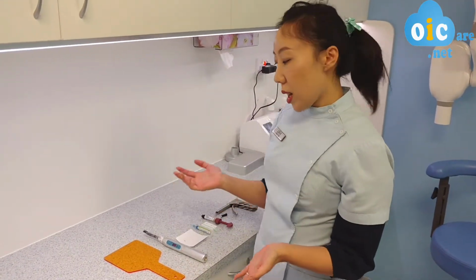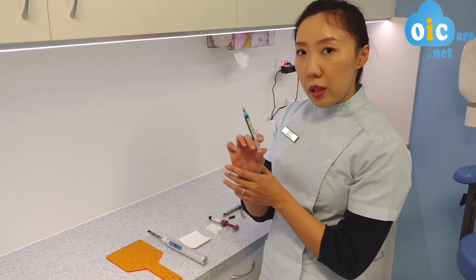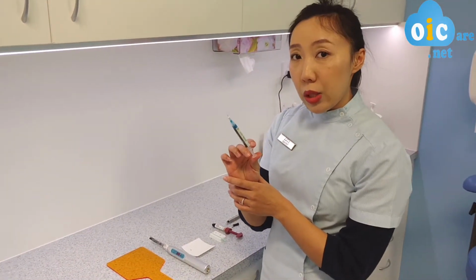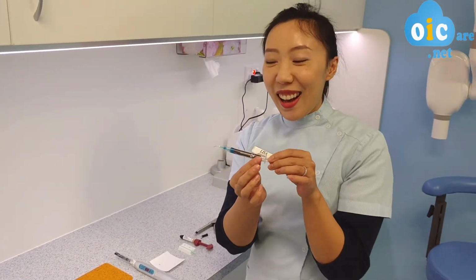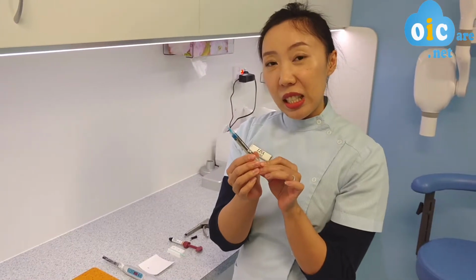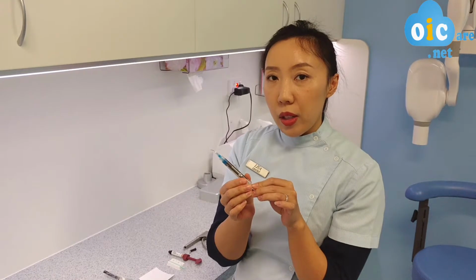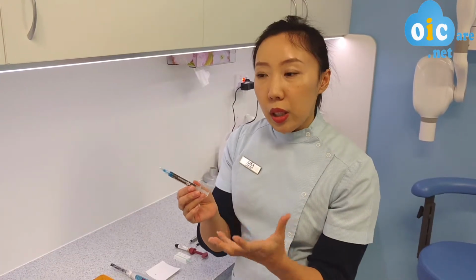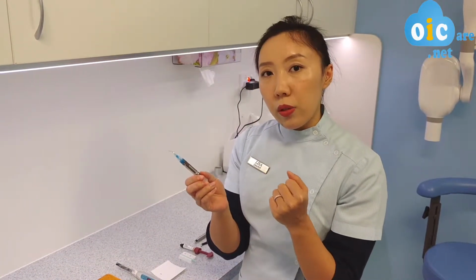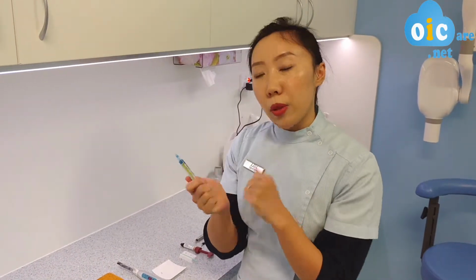After we put the matrix bands on, we will start to treat the tooth surface to prepare it for the filling material. The first thing we do is use this blue gel. This is called etch, which is phosphoric acid. What this does is roughen the surface of our enamel. Once the surface is roughened, we get an increase of surface area, which increases the area of bonding. So there's more surface area for the filling material to stick onto, so that it is stronger and wouldn't just come away from the tooth.